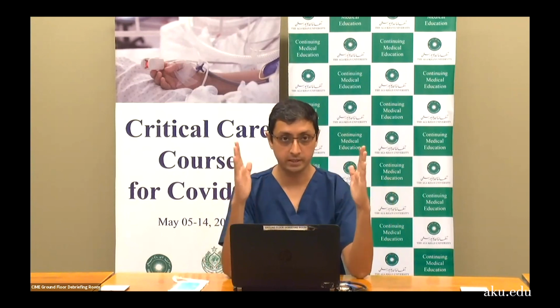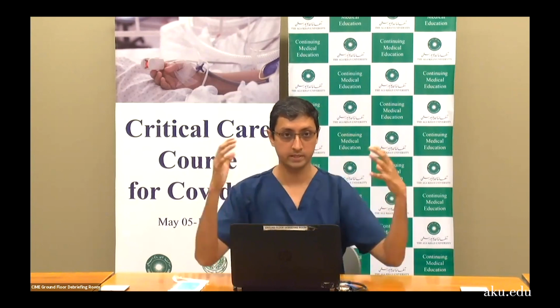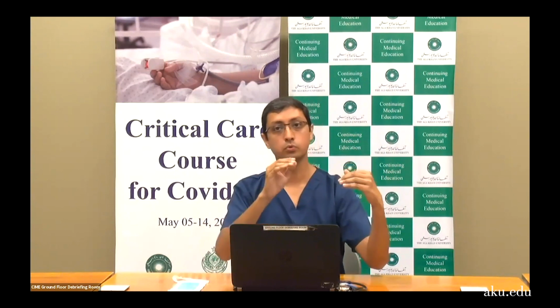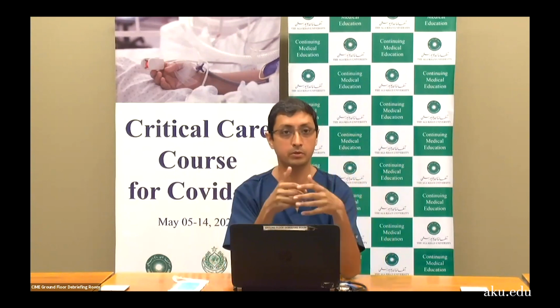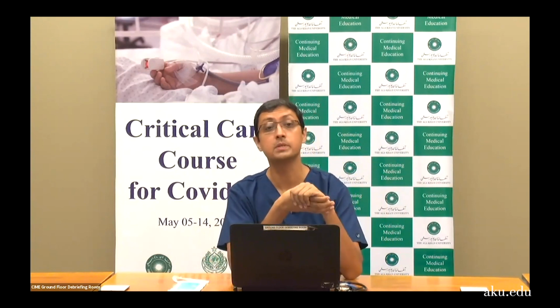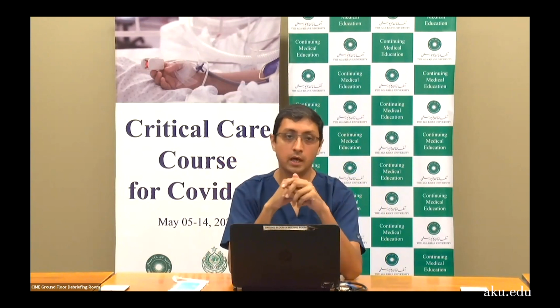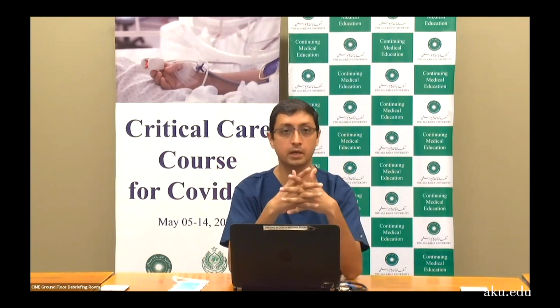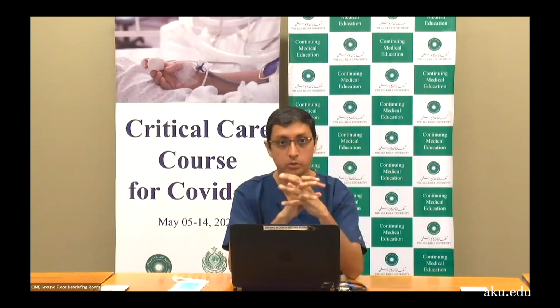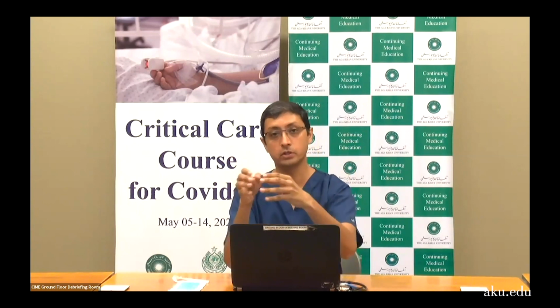For example, thoracic cavity has the lung and the heart. So if the heart is moving like this in the thoracic cavity, every contractile activity of the heart is going to do air displacement. That may trigger it as well. So if the patient's heart rate is 120, it may be triggering at 120 as well. So there are trigger settings. Generally speaking, there is no magic number, but I start with a magic number of 2. That's about it. 2 centimeter water, 2 liters per minute, whatever it is, and work your way up and down. The higher the trigger, the more effort the patient needs to make.